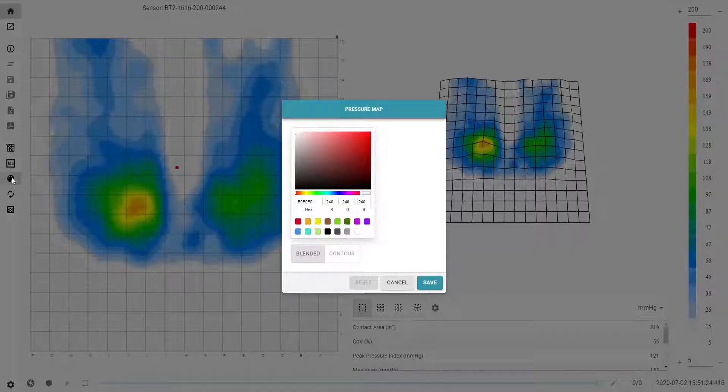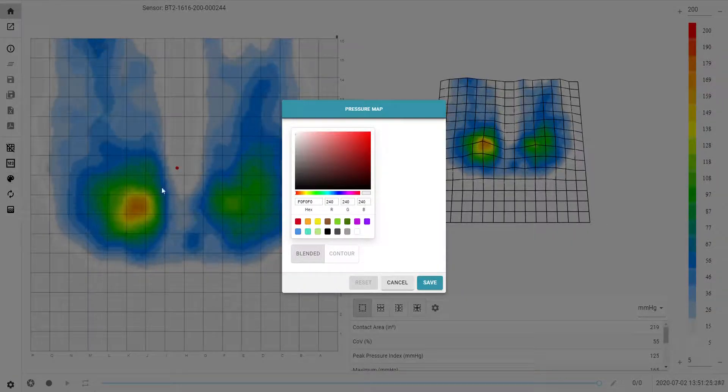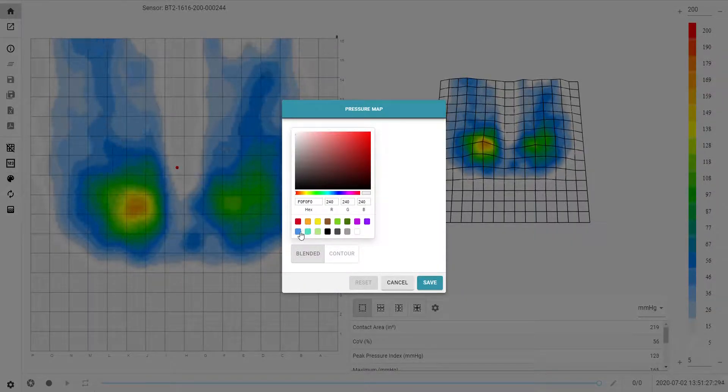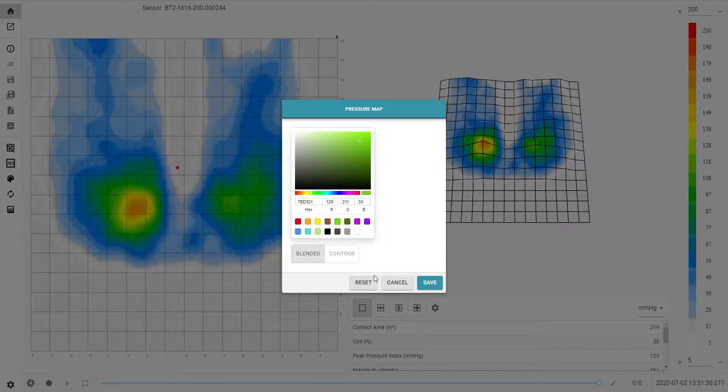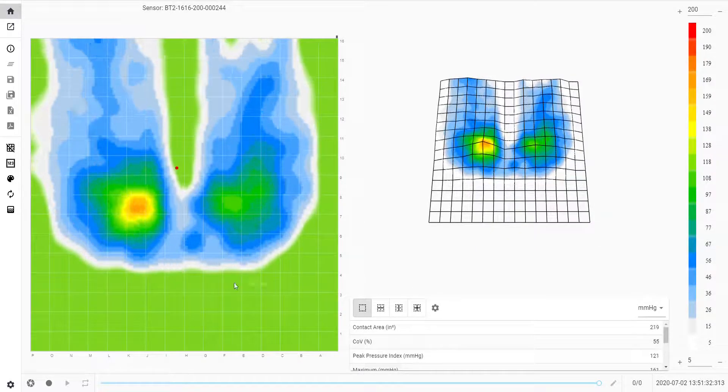Next we have the colour background icon. Here you can change the colour of the background. This could be for aesthetic purposes or for colour blindness, for example.